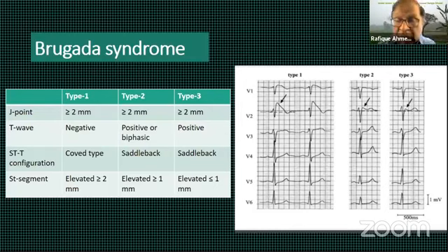So I had a patient who came with flu-like symptoms and had a Brugada ECG. That is one way it can manifest. This group is a diverse group of patients. It's very difficult. What Dr. Shafiq did for this patient is appropriate.